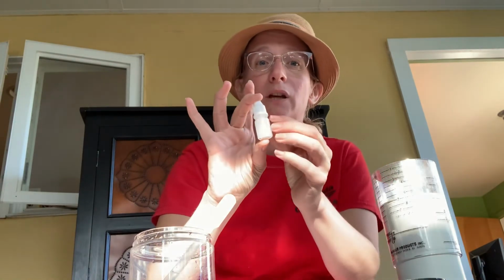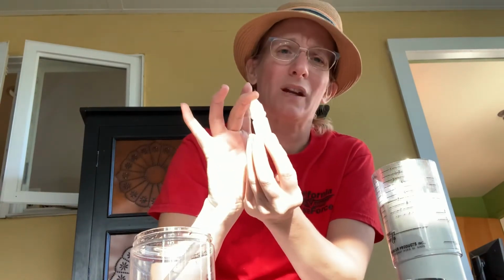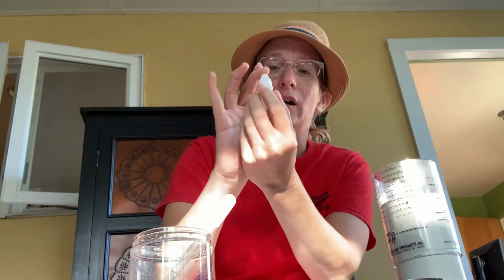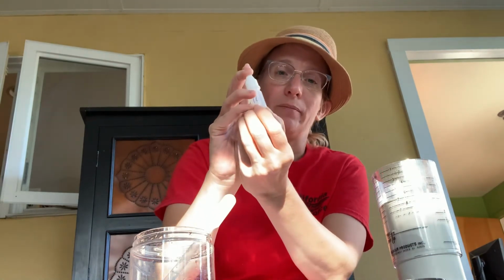If you have American Foulbrood, this will no longer be milky and cloudy and white. Instead, it will be pretty much clear and kind of a yellowish gold color, looking a lot like apple juice. And then the solid parts will have precipitated out. So basically the milk is going to kind of curdle in here, and you're going to have the liquid part be that golden color, and then the solid part will precipitate out.